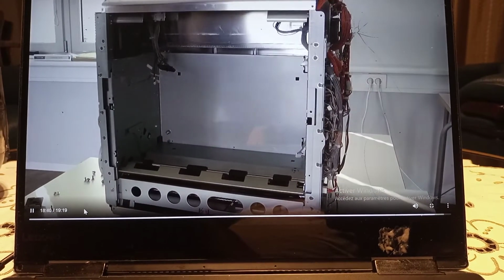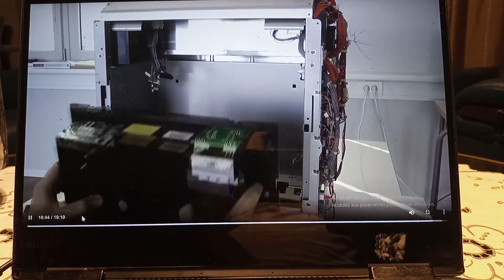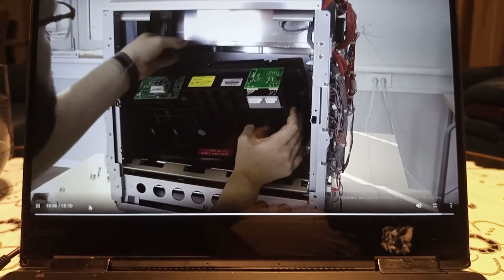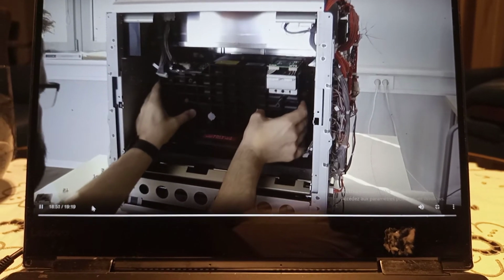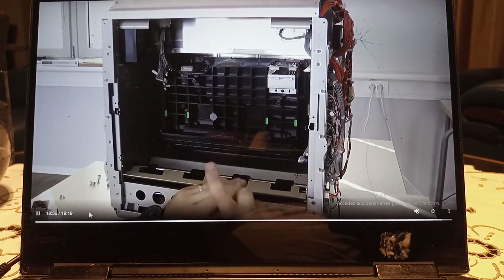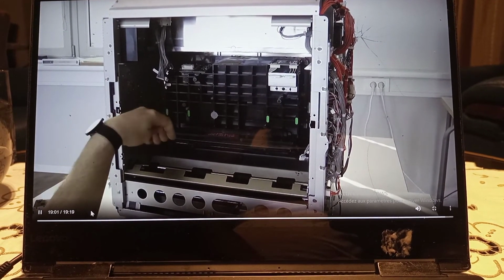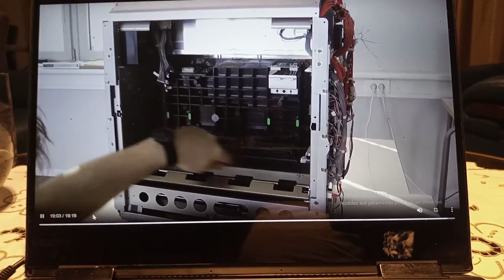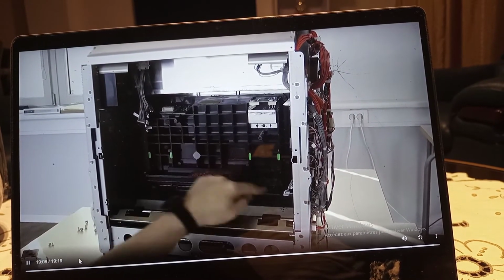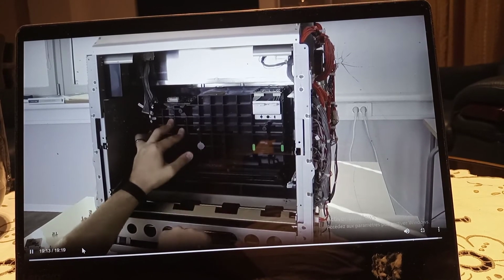Okay, to put the spare unit back, the spare optics unit, just put it back like you removed the one before. And before you tighten the screws, make sure that it's sitting on the lower bolts. We have 2 bolts here, and also it's firmly attached to the right side bolt. So keep it down and right, and now tighten the screws.